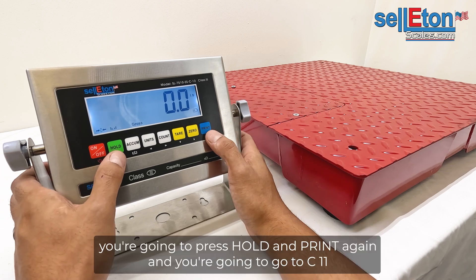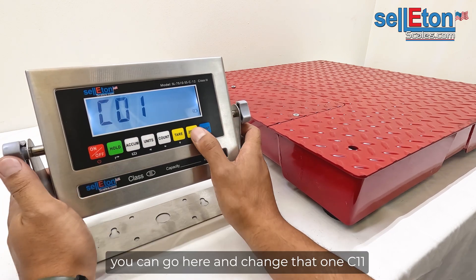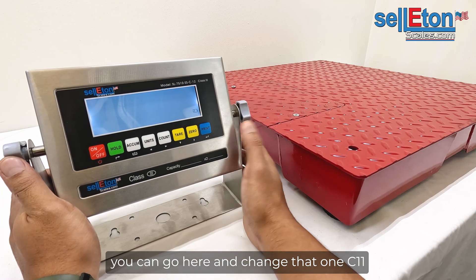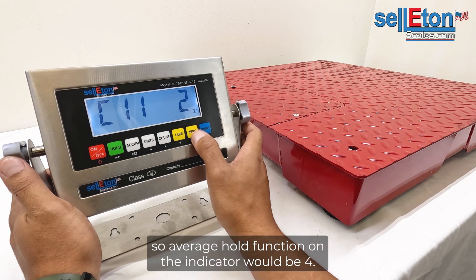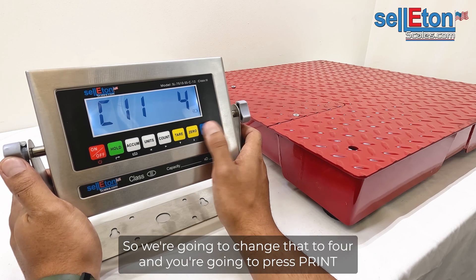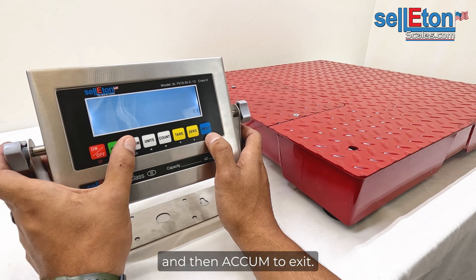To do that, you're going to press hold and print again and go to C11. Change that to one — C11. The average hold function on the indicator would be four, so we're going to change that to four and press print. Then ACC one to exit.